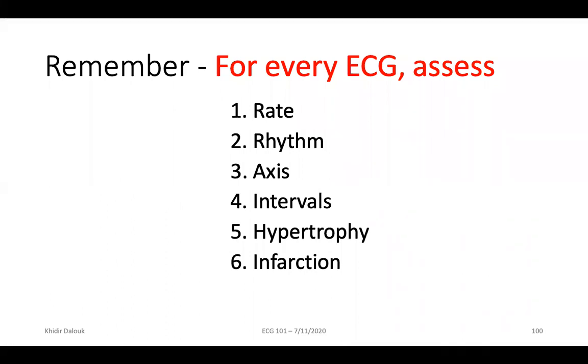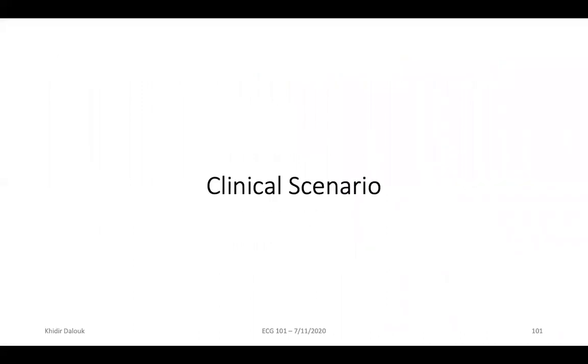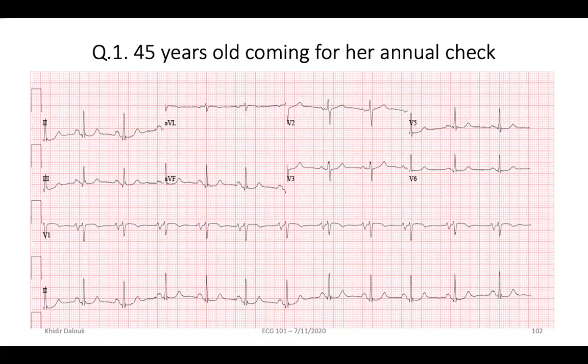Learning is repetition. Every day look at an ECG. If you have problems reading an ECG, feel free to email me, or email any of your colleagues who know how to read ECGs, and we can go through it. We presented a few cases or scenarios, so we can go through them. I think you've already had the PDF.